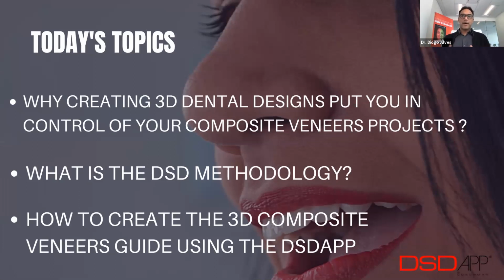Today, we are going to be talking about why creating 3D dental design puts you in control of your composite veneer projects, what the DSD methodology is, which is very important, and how you can create a 3D composite veneers guide using the DSD app. The way that I structured this webinar today was in a way that I think you guys will understand: how it is to become a digital dentist from the beginning to the end, when you deliver that to your patient.